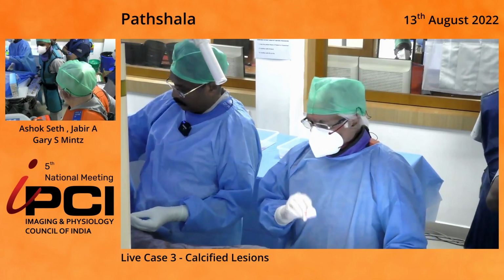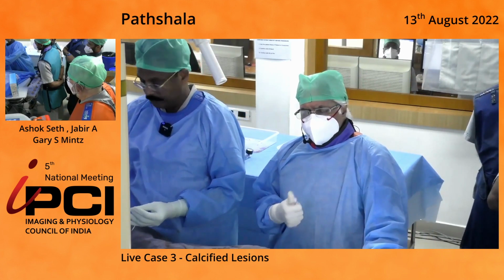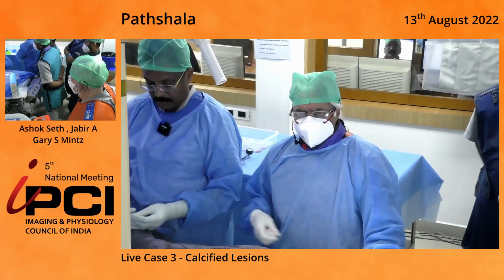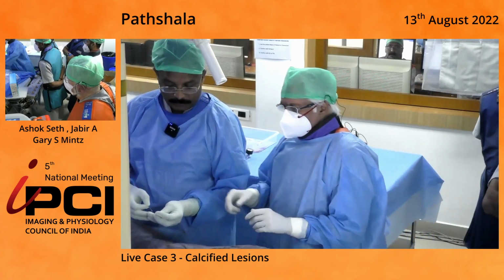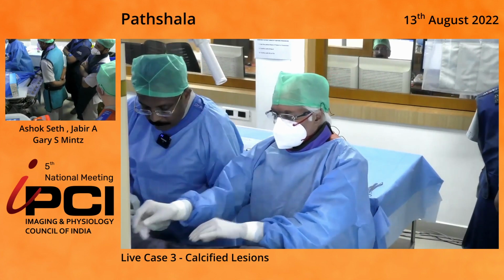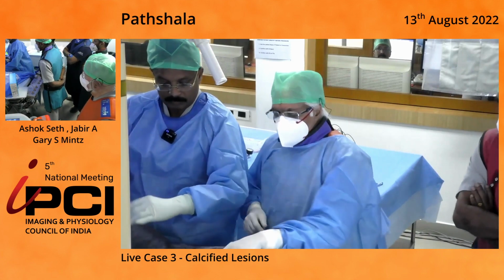So I'm thinking 3 steps ahead in terms of support and in terms of delivery of any devices and in terms of any complications that we may face. So here we are. Yeah, I think that's fantastic. I think that sometimes delivery, particularly in an underexpanded segment of the IVL balloon, can be fairly challenging, even with the OPN balloon.